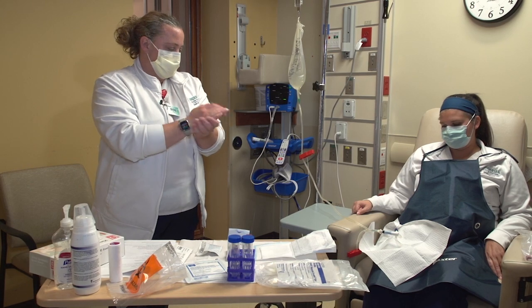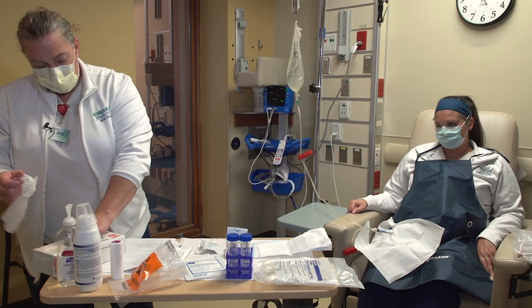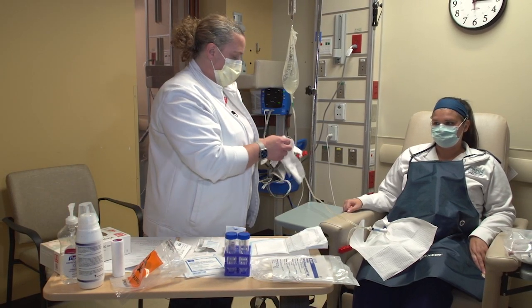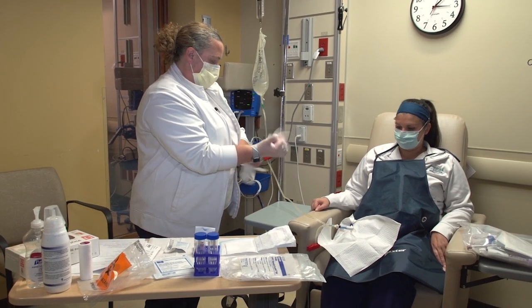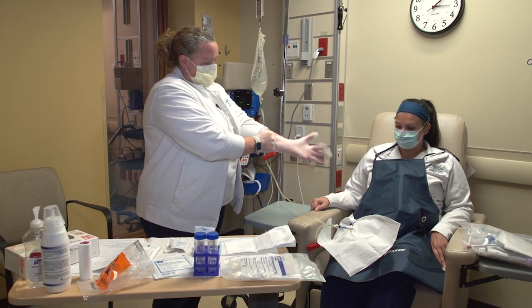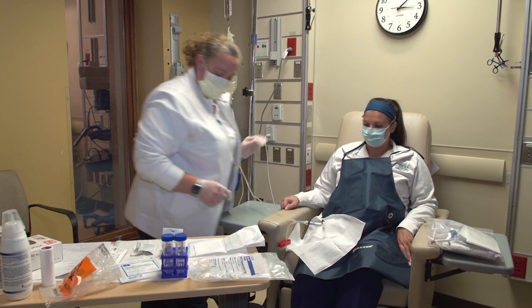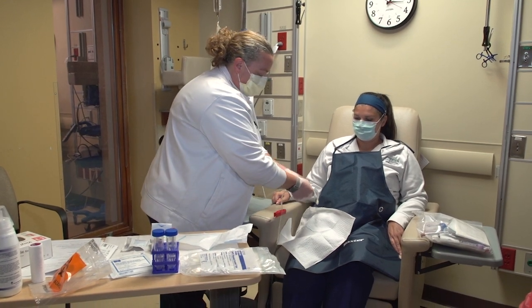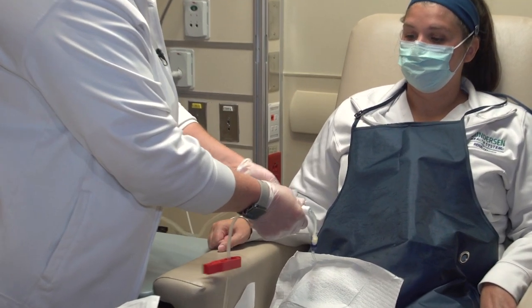Sanitize your hands. And you close the twist clamp on the transfer set, and again, you'll scrub around your transfer set for 1 minute.